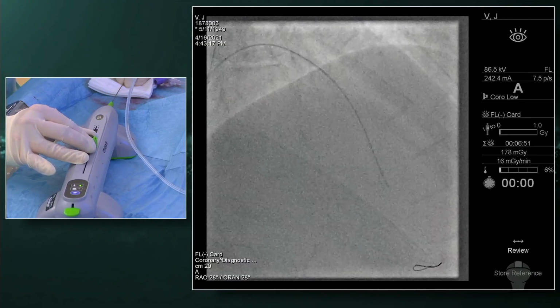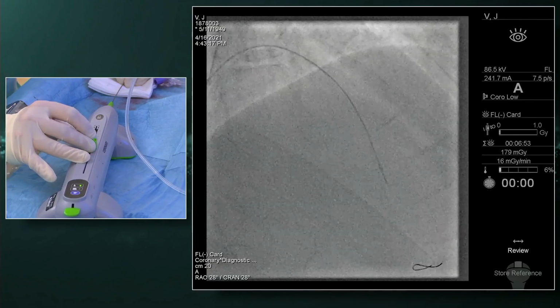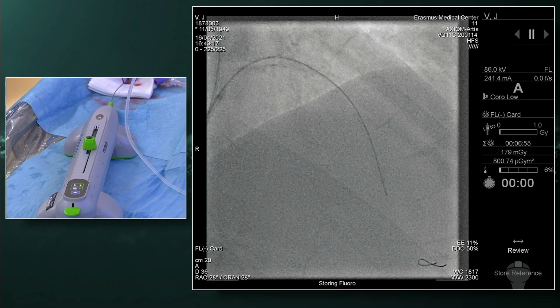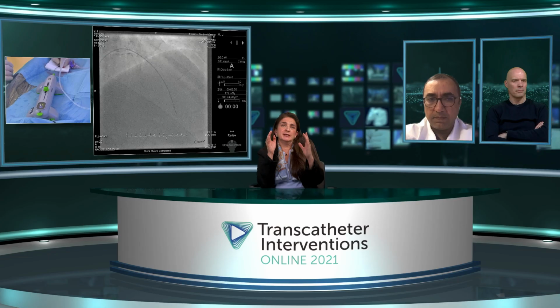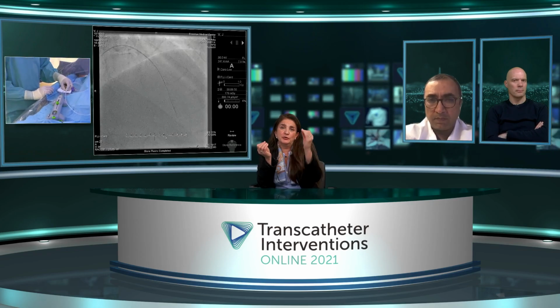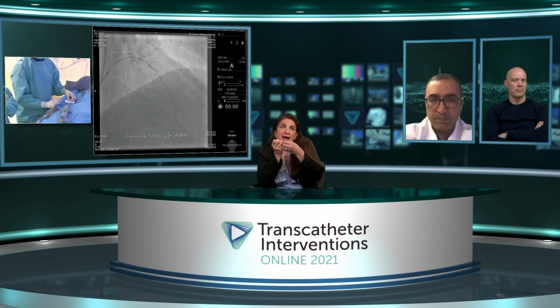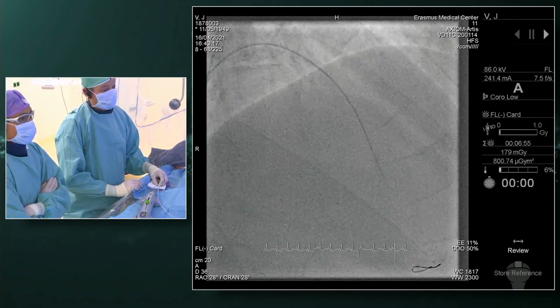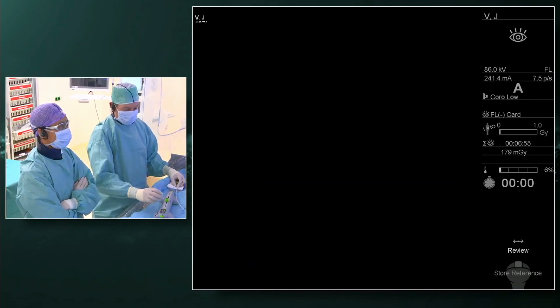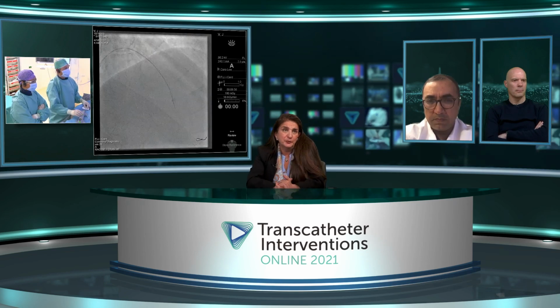After 20 seconds, when you hear the audible sound, we stop. We typically stop outside the lesion. It is a very slow, methodical way of going through this lesion, coming back very slowly for 20 seconds on the lower speed.